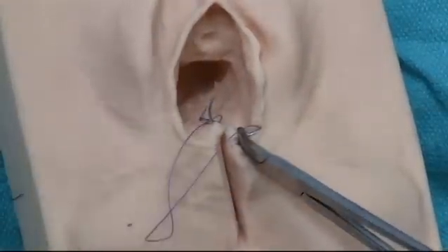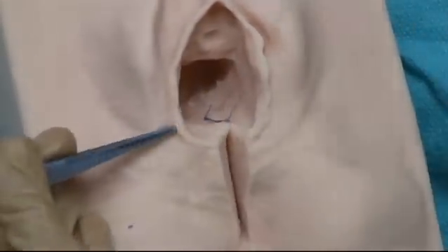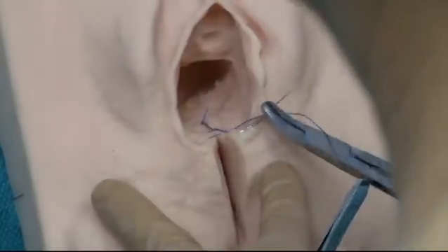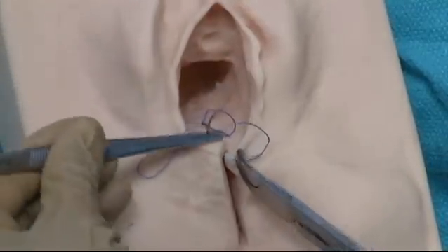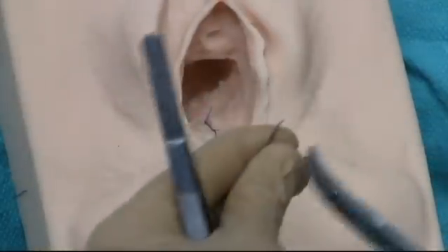I apologize in this video for the small amount of suture material I'm using — that's going to make the knot at the end a little hard to demonstrate. So I'm just at the inside of the hymenal ring, and we're going to go on the inside of the ring, lock it, and then come out to the outside of the hymenal ring and lock that.